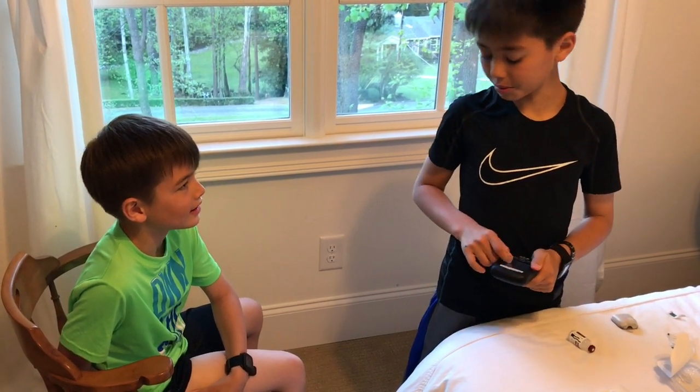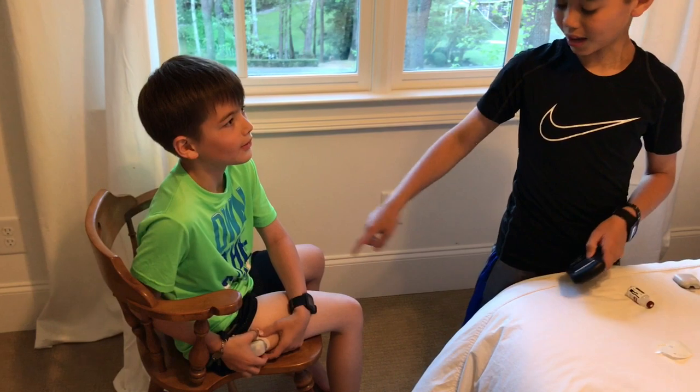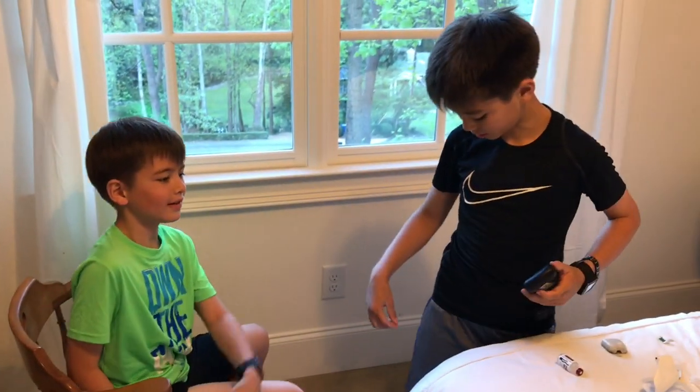It will be clicking for a few moments. That louder sound — that's when the needle will go in.